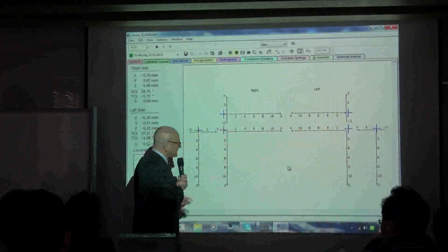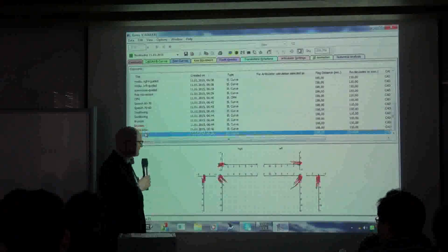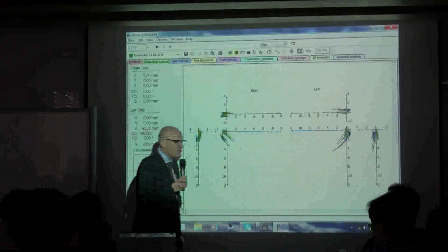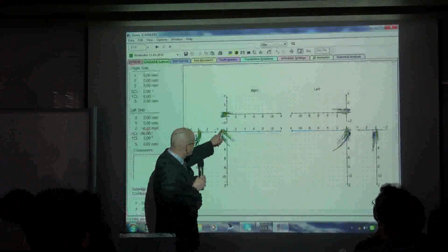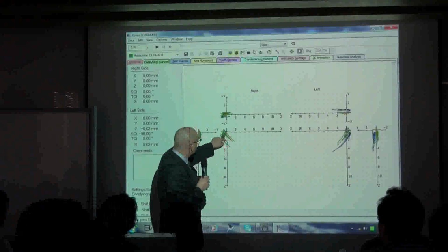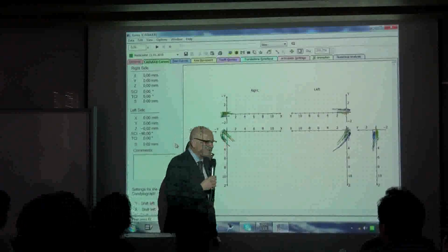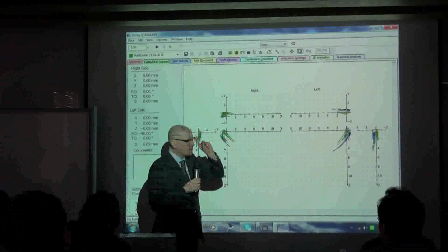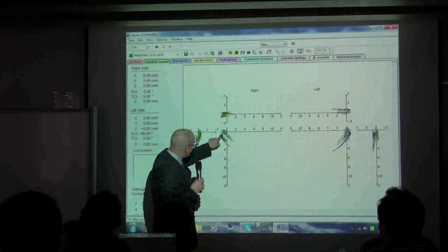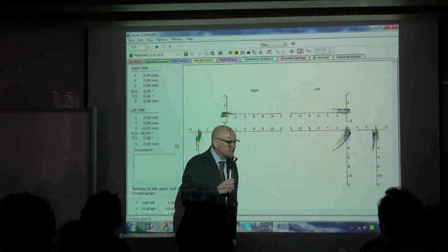Okay. Mastication, please. And this is very impressive. Mastication movement. This is the beginning of the movement. Apple is soft, but already strong problem here. Going backward, deviating left and right, and later on, the skin of the apple, she needs to have real force.